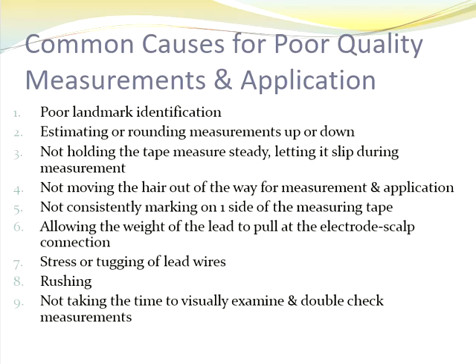Some common issues that are very common throughout sleep and EEG in general for not only measuring and applying the electrodes, but not accurately identifying the landmarks, getting them mixed up with where they are or what they are. You never want to estimate or round your measurements. Try to be as precise as possible. I know the math is probably going to hurt your head at first, but you will get used to it and it will become second nature to you.